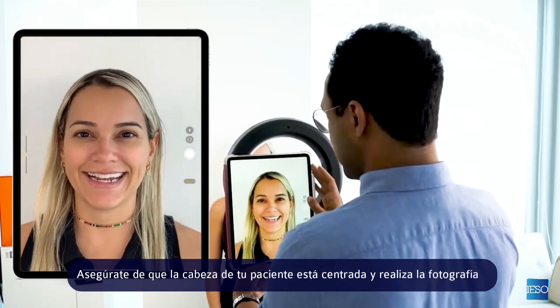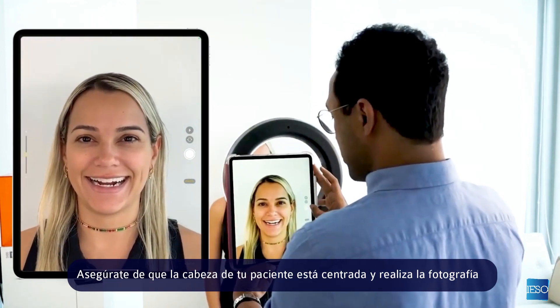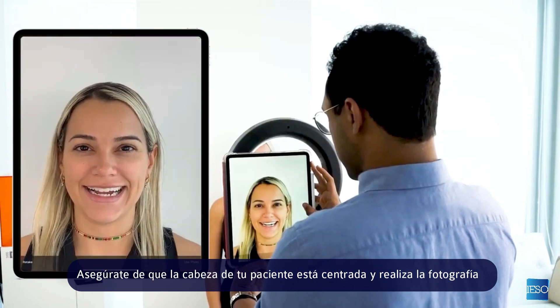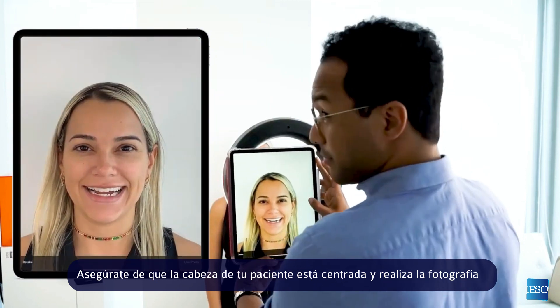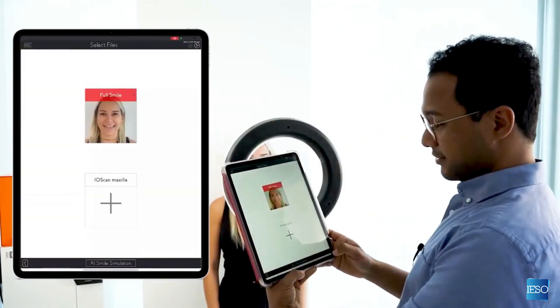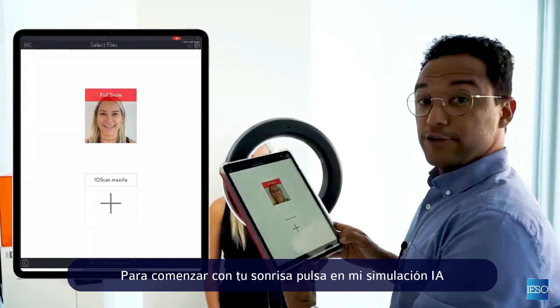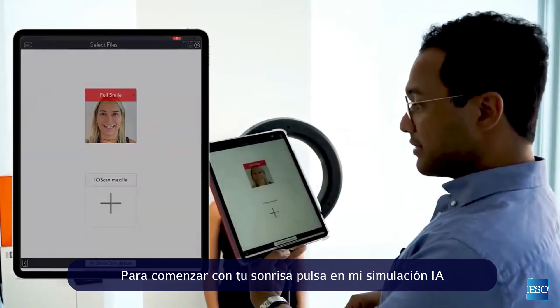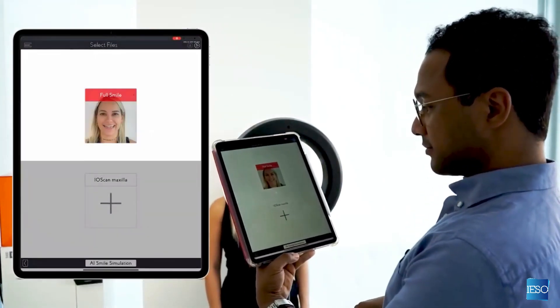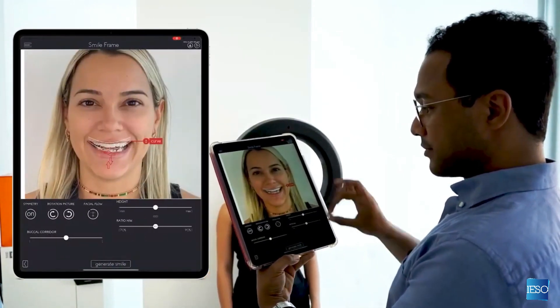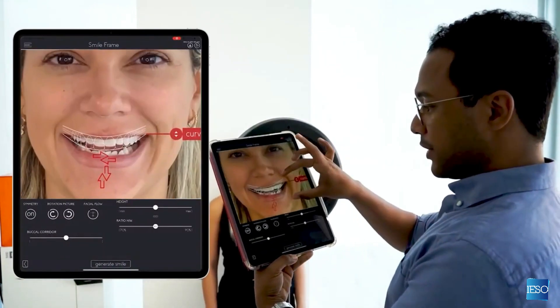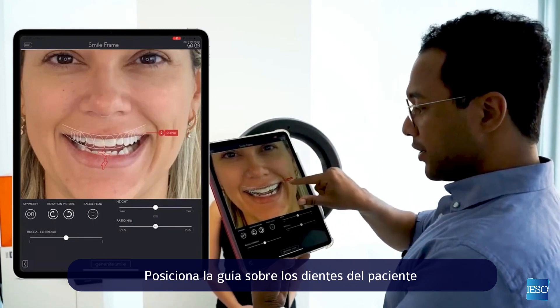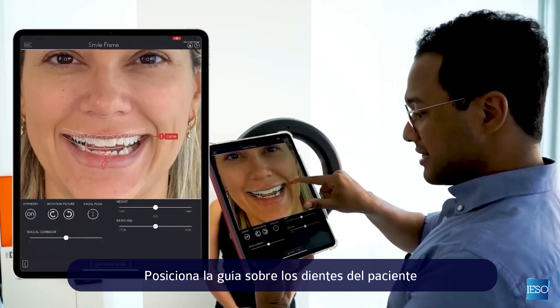Make sure that your patient's head is centered and take the picture. To begin your smile, tap on AI Smile Simulation and position the smile outline over the patient's existing teeth.